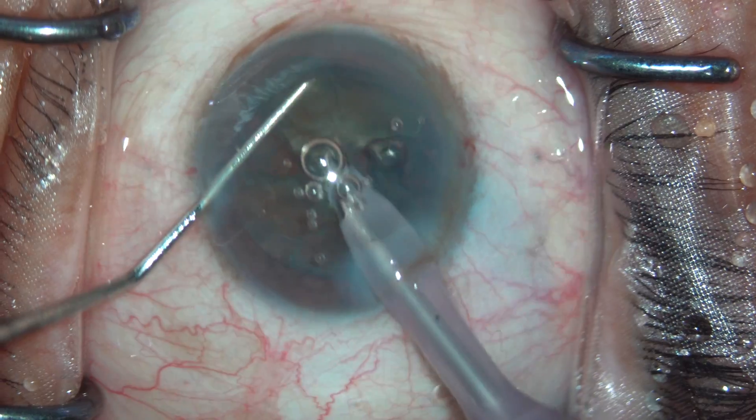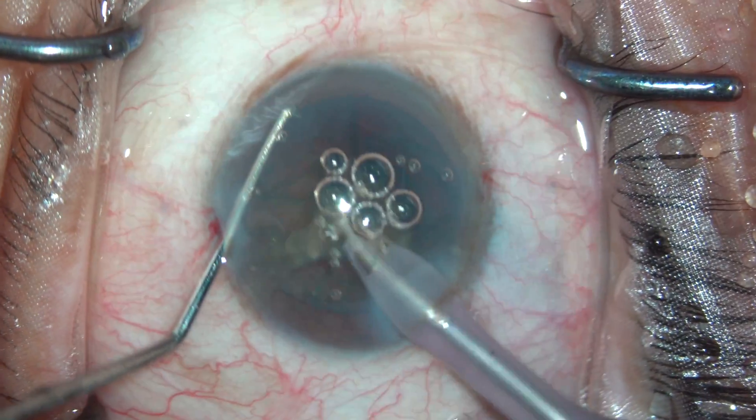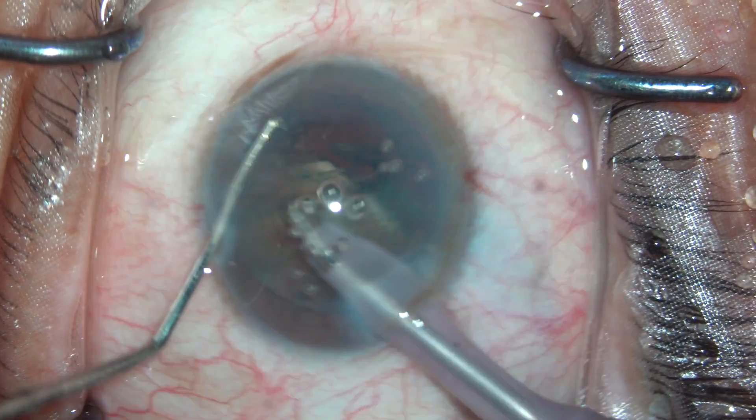You can see that multiple times air bubbles are coming. For beginner surgeons it is imperative and important that you take these out; for an expert surgeon you can go ahead.